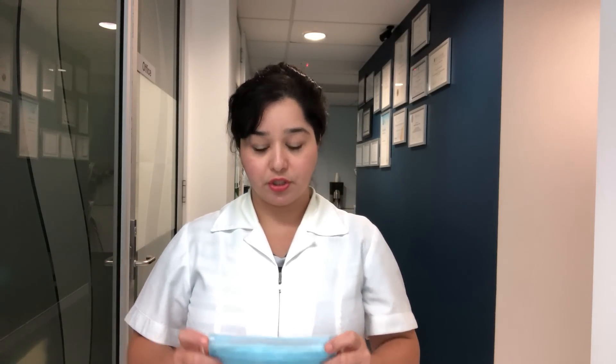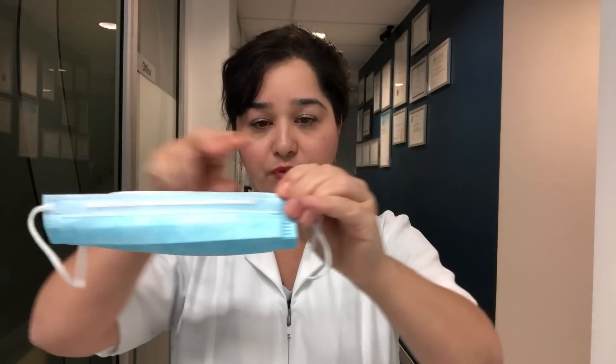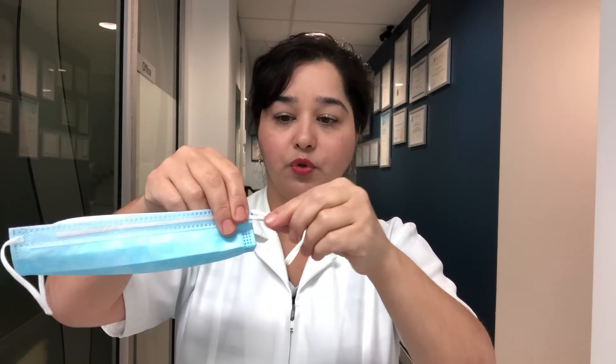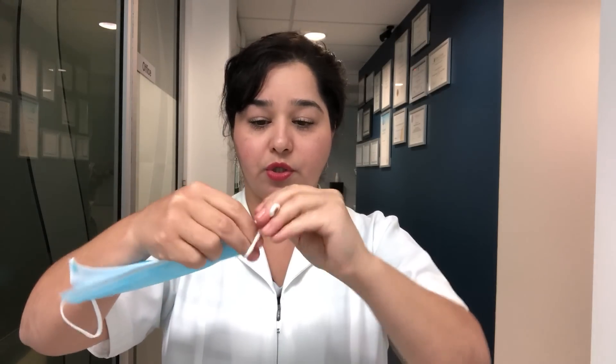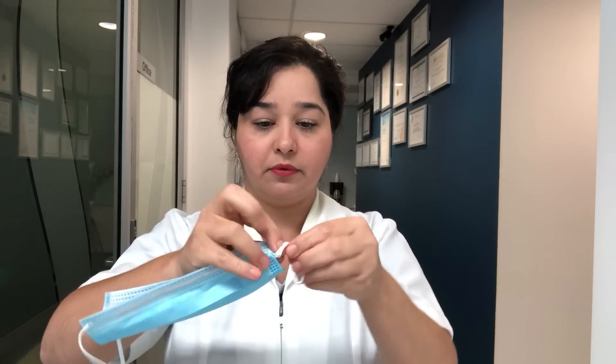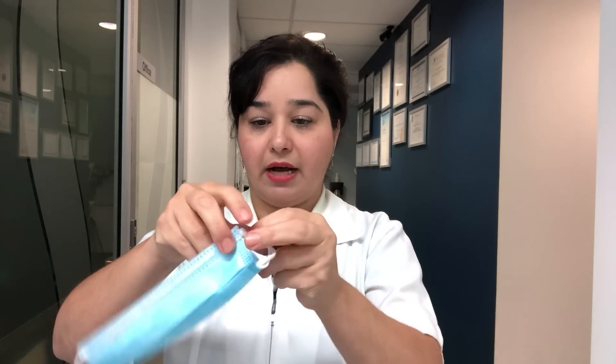I would like to show you a way to make your normal level 2 surgical masks fit a lot better so that both you and your patients are better protected. What you need to do is fold your normal surgical mask in half, making sure it's edge to edge, and then with the elastic on each side make a little knot as close as possible to the actual mask.